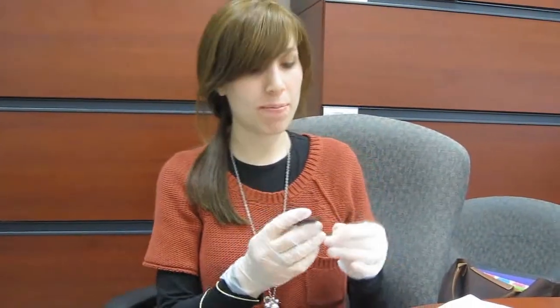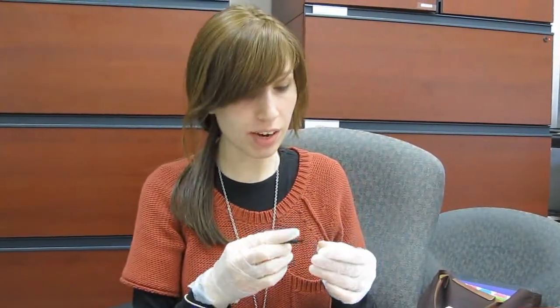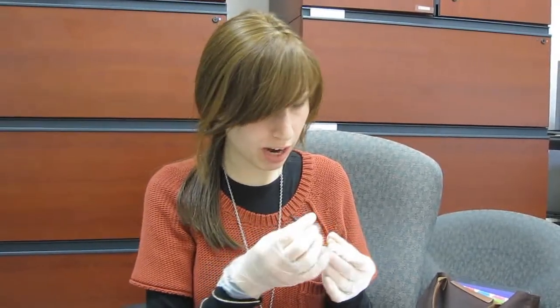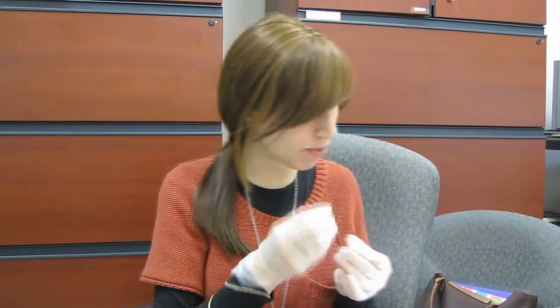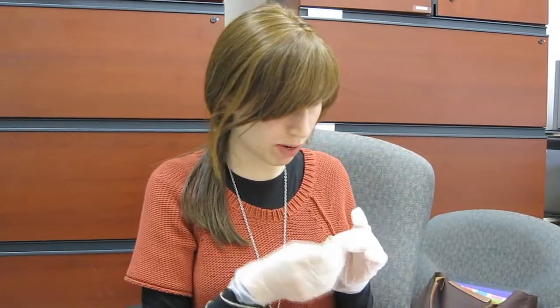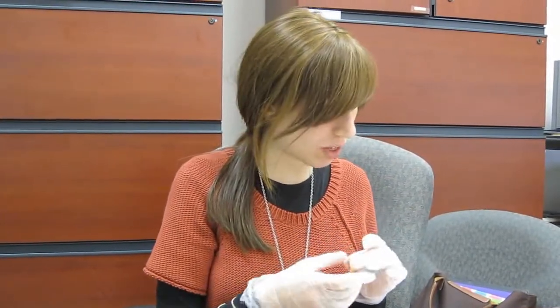Okay. We're doing the visual inspection of the in the ear hearing aid. So we're just going to clean it off, make sure it's clean. Check for any wax. Clean it out for any wax, and you know, any breaks or cracks we want to check for. And it looks like everything is pretty good.